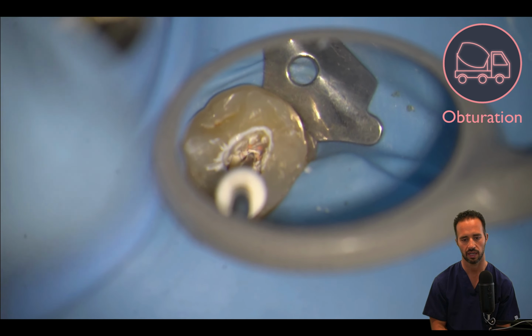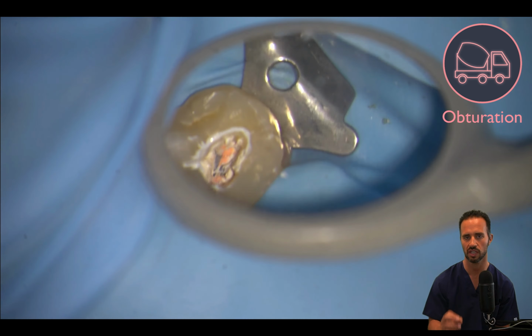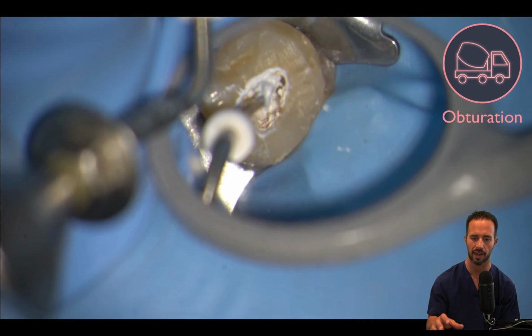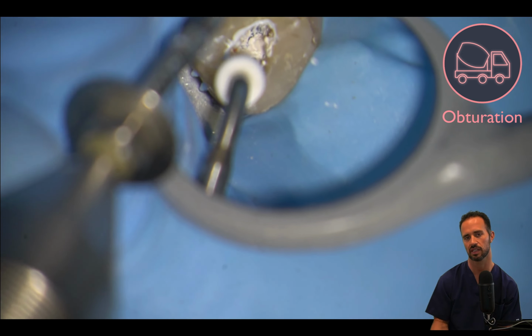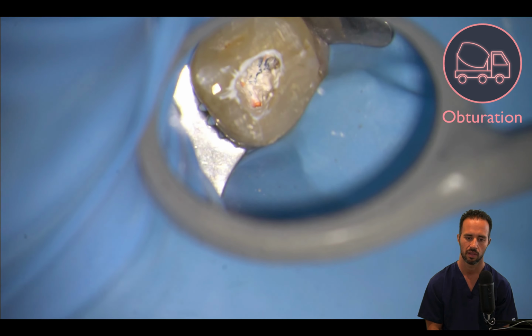And we're just cleaning up the area, trying to be left with just the right amount of gutta percha. You don't want to give yourself so much excess gutta percha that you're compacting something that's 2 millimeters above the orifice level. So you want to sever right at the orifice level, or maybe even slightly above the orifice level, so you have a little extra to compact with.